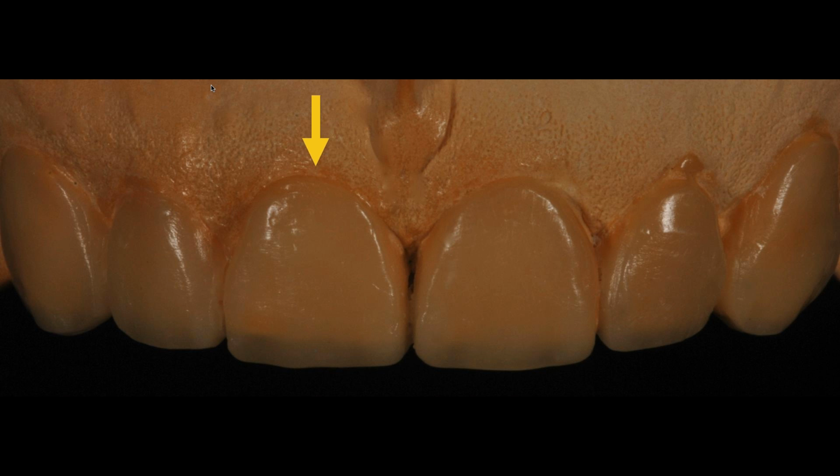But now we have a cast, and we're going to develop a wax up on this cast. So what kind of information do I get from this? Well, I can use her intraoral photos, I can use the cast photos, and I can do a digital wax up. And then that digital wax up, transformed using the digital smile design, I can transfer to a real wax up.